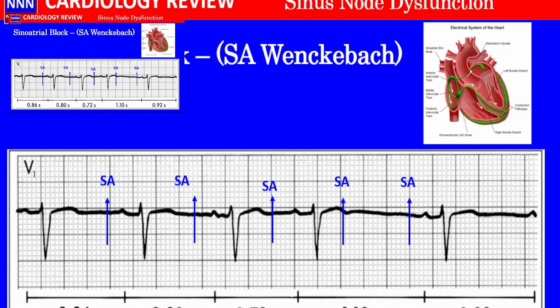That is in the AV nodal Wenckebach block, whereas with sinus exit block we see a similar picture, except you have an imaginary sinus activation here recorded by an electrode, and we have the sinus node, and they are going at a constant rate, just like the PP intervals. But by the time it activates the atria, there is progressive prolongation of the sinoatrial interval.